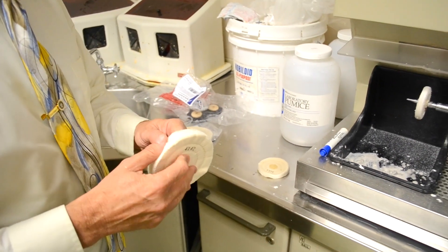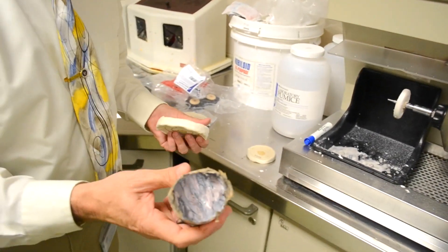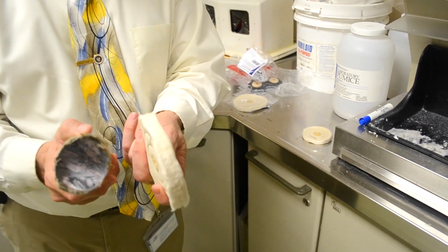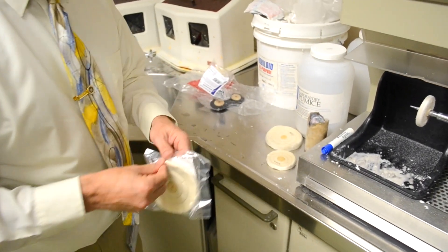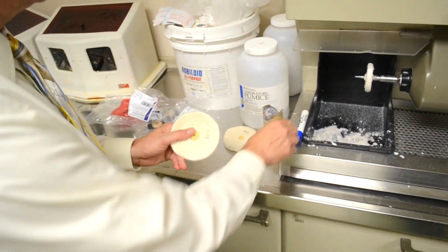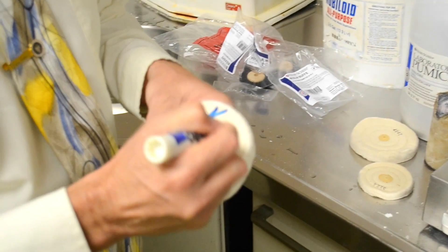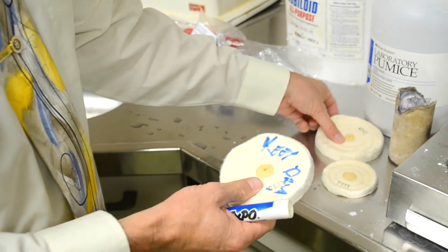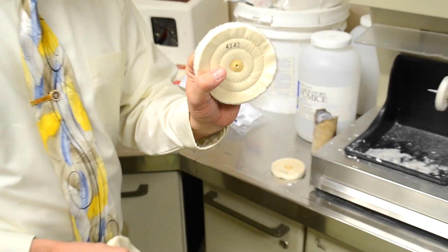The next size pad is going to be for your Acryluster. Your Acryluster pad may get to the point where it looks worn — I'll show you later how to clean it. The third one is your Keep Dry pad. Always take your last one for high shine, and you'll want to write on it because sometimes you get confused which one is your high shine, your Keep Dry, and which one is your compound.